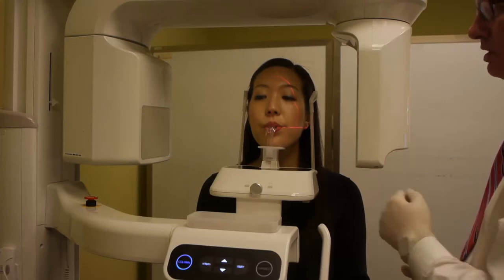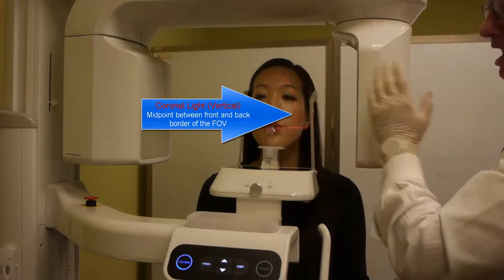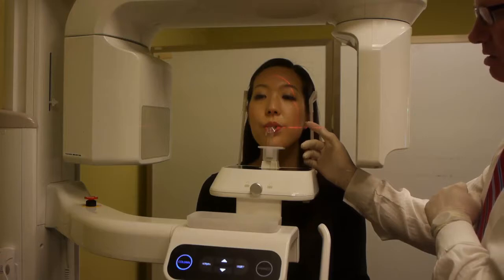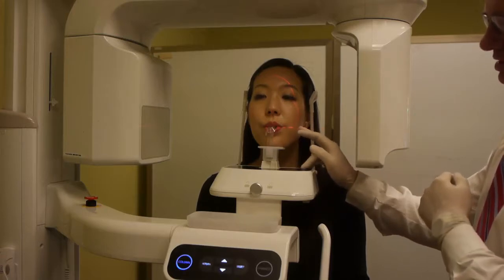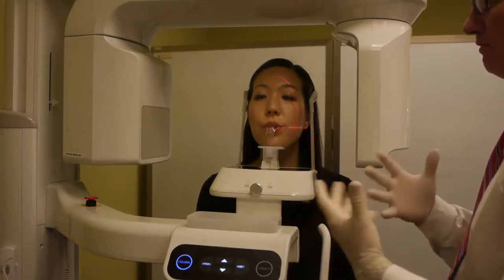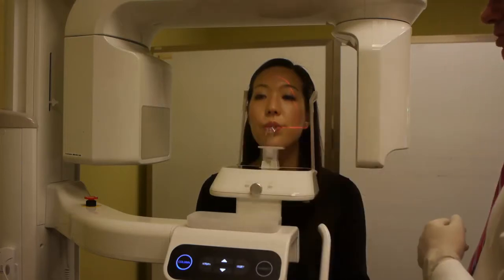My coronal light that we see on the side of the patient's face, this one right there, is my midpoint between the front and back border of my scan. So in this case, I'm going to capture 4 centimeters of anatomy in front of that light, and then 4 centimeters of anatomy behind that light. That is essentially my target, but again, targeting is shown on the left-hand side, while capturing the same amount of anatomy on the right-hand side of her face. You want to follow our same scan protocols to capture this quadrant showing the upper and lower arch.